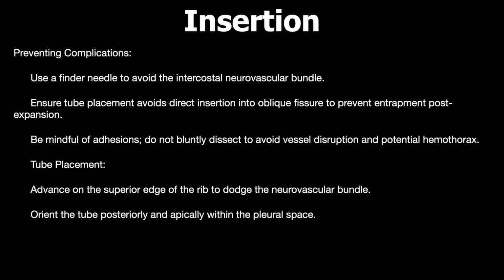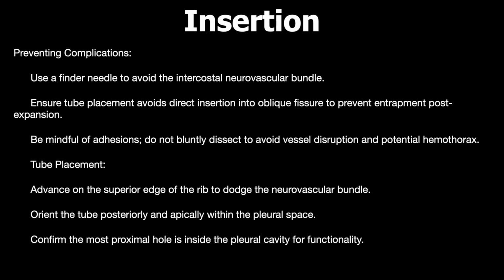Orient the tube posteriorly and apically within the pleural space as I have shown. Confirm the most proximal hole is inside the pleural cavity for functionality. These are all things which must be clearly kept in mind when you are inserting a chest drain. The last point is very, very crucial: ensure that the proximal hole is inside the pleural cavity and not just inside the skin.